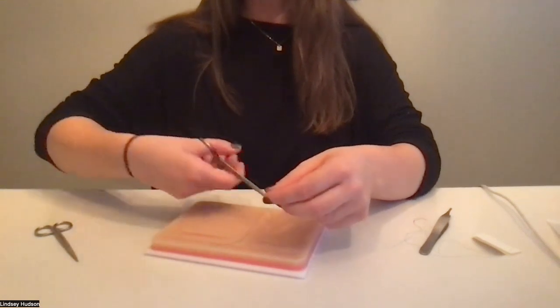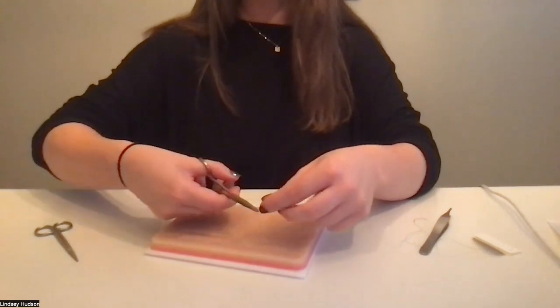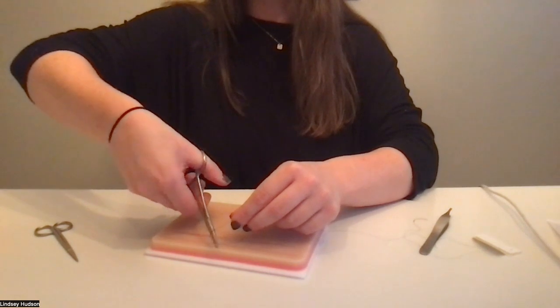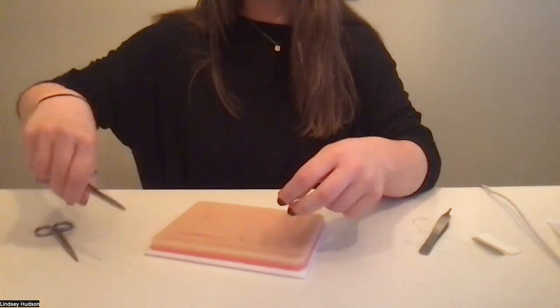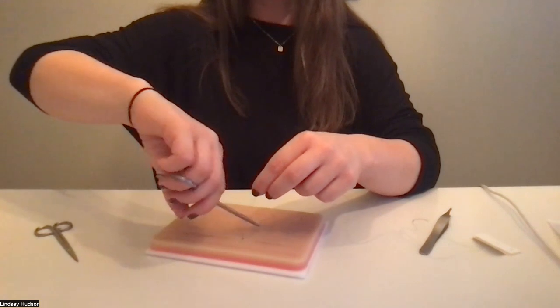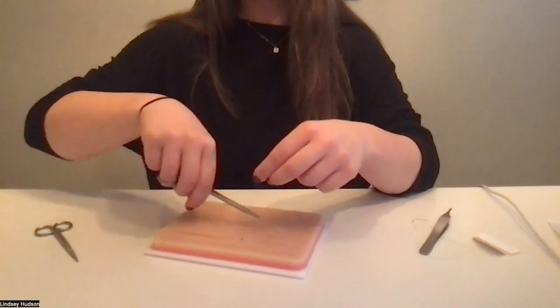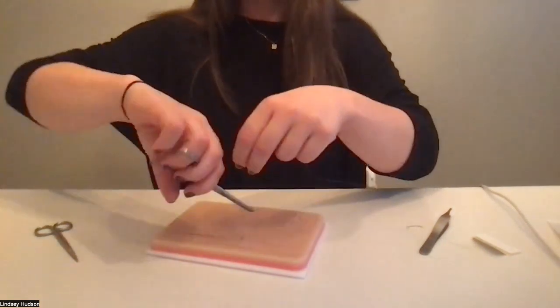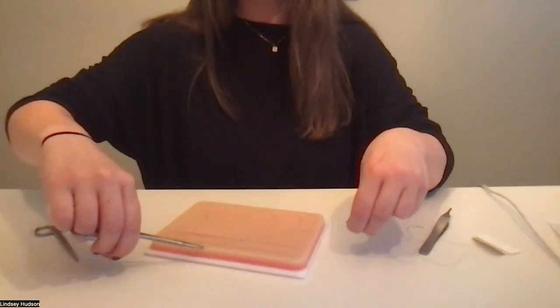To strengthen that knot, you then want to go the opposite direction. So we just went over, so now we're going to go under. We're going to loop it one time, and then we're going to grab onto our tail and pull it through. You're going to do this one more time. So you're going to go over, grab your tail, pull it through, and then you're going to go under, and that's running away from me. Grab it and pull it through.